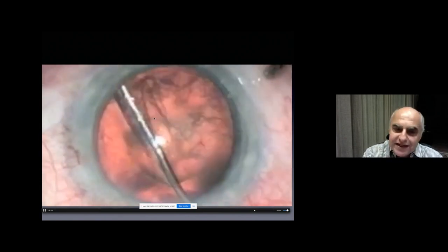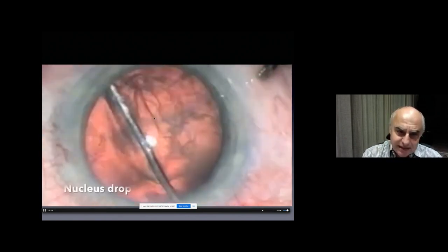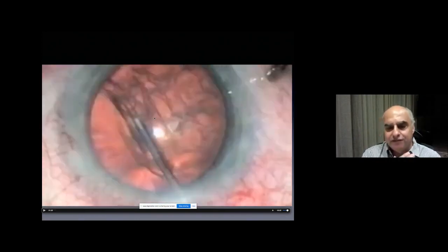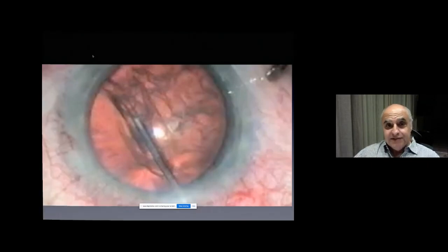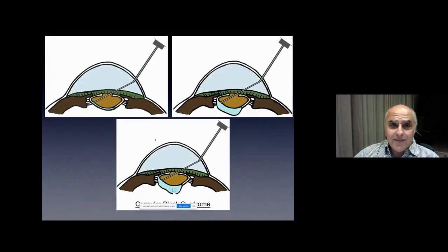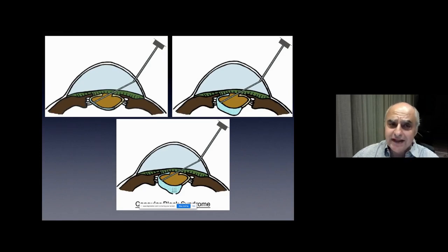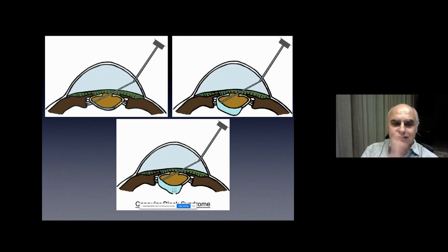You have to see it once to avoid seeing it again, because it's a really bad complication very early in the surgery. It's very important to be aware. What happens if you have a small rhexis, a bigger nucleus, and you inject forcibly? You don't give time for the wave to pass to the other side of the nucleus. That's why the proper technique of hydrodissection is not just injecting — you have to see the wave passing to the other side.